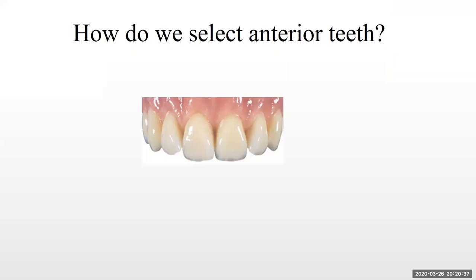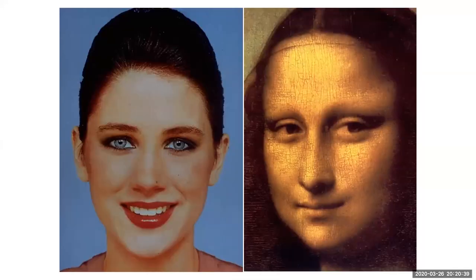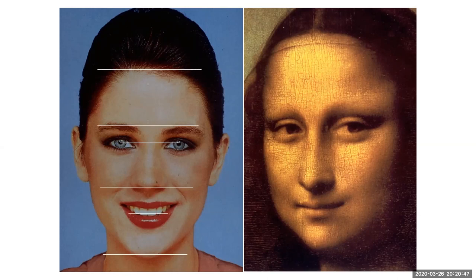So how do we select anterior teeth? Well, facial form equals tooth form. We're going to break apart this face and split it down the middle with the midline, as you can see here. And we see the pupil line, which is the occlusal plane. We have the midline, and we'll have cuspid lines here. So all this information was given to us earlier on the occlusal rim.